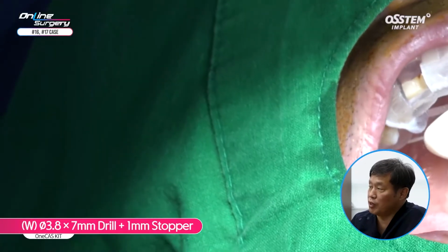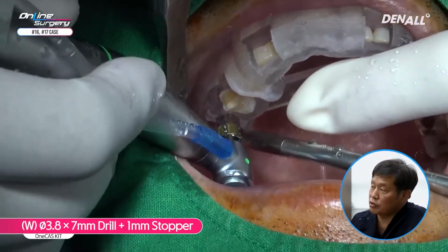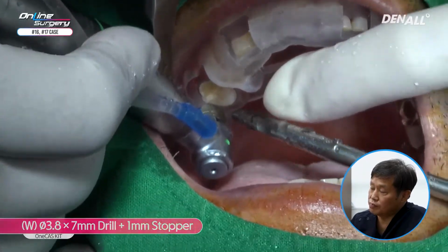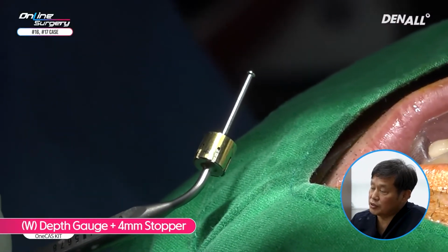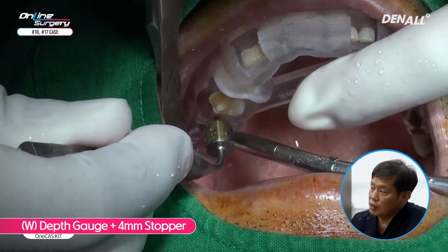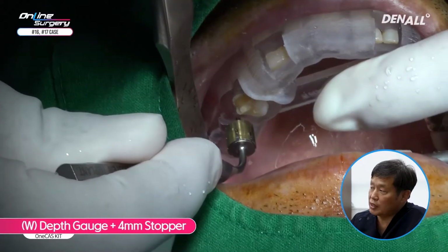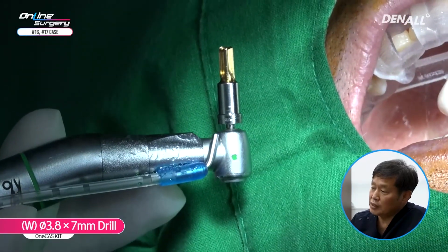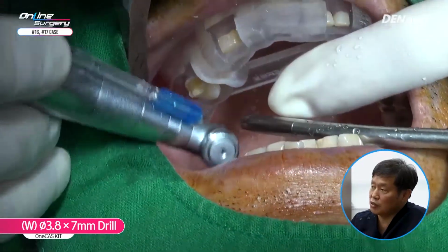Gradual progression is done by 1 millimeter. Drilling is done up to 6 millimeters. It's not penetrated. Depth gauge with 4 millimeter stopper is used. The stopper is not in contact with the template, so you can check that the sinus floor is not penetrated. Next is 3.8 by 7 millimeter without stopper. Drilling is done up to 7 millimeters.